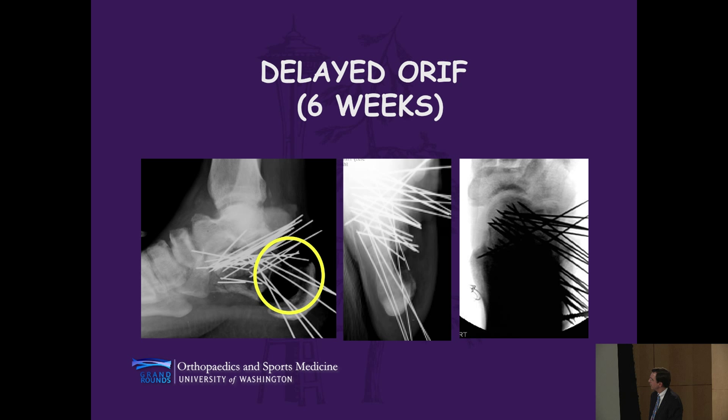This was bone grafted actually with just cancellous bone graft. That's at 6 weeks, and here he is at a year, with slight settling of his morphology, but a reasonable maintenance of the alignment of his foot.